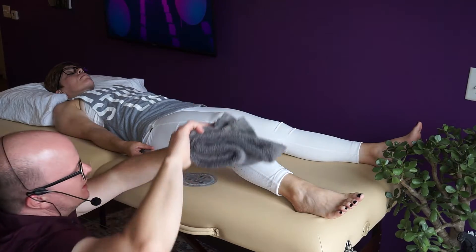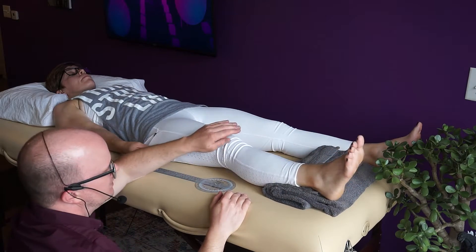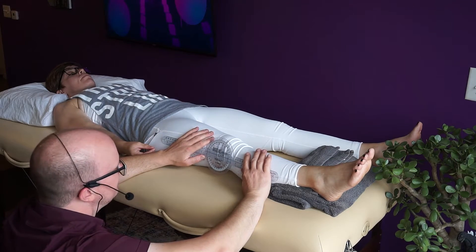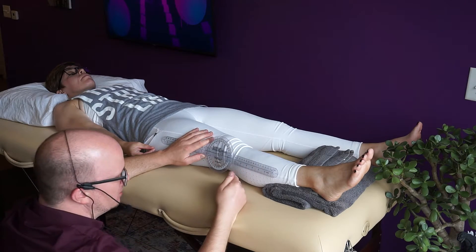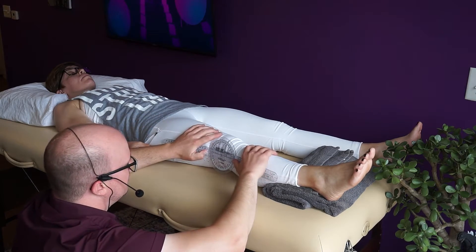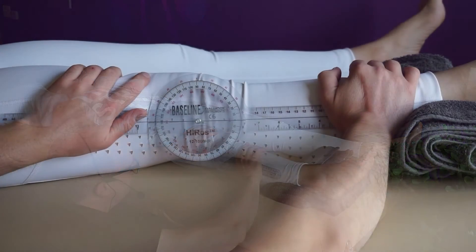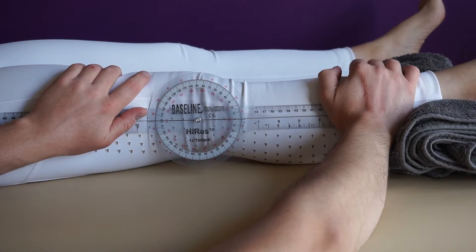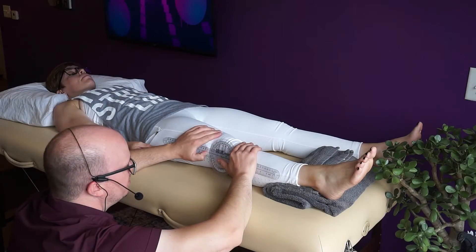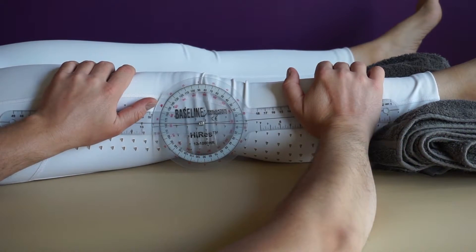Now let's look at knee extension. Some extension measurements are harder to figure out at first. With knee extension, we're trying to get straight — so what do we do if they can't get straight? They'll be lacking degrees. Line it up with the same landmarks and cue her to push her knee down into the table, tightening the muscle. Actively on her own, she has one degree of hyperextension. I apply a little pressure on the distal femur and proximal tibia, and I can get her to a firm end feel — which is what we'd expect — of five degrees of hyperextension.